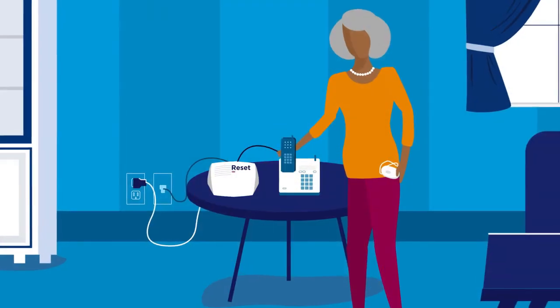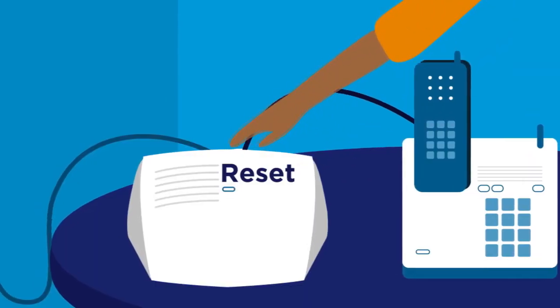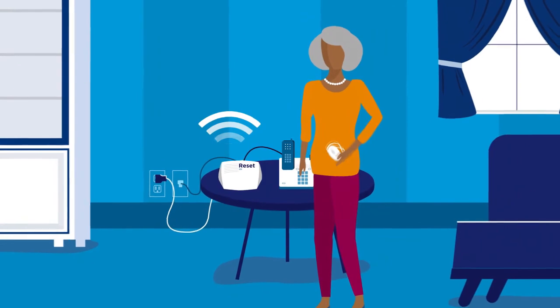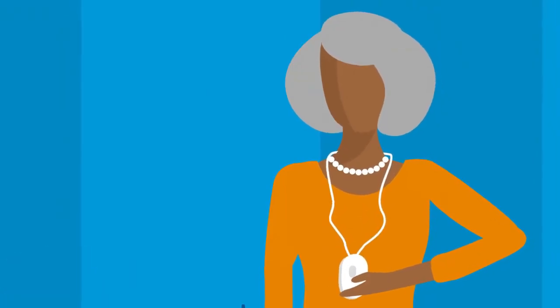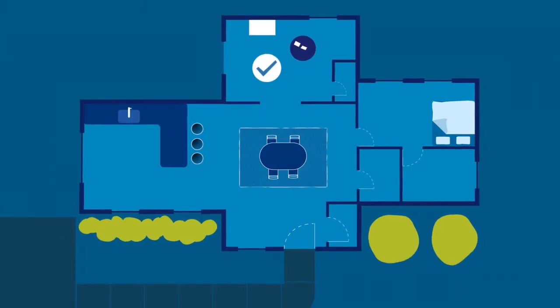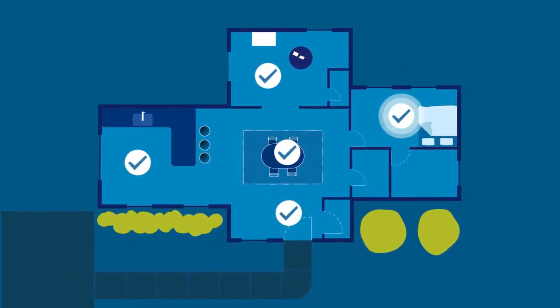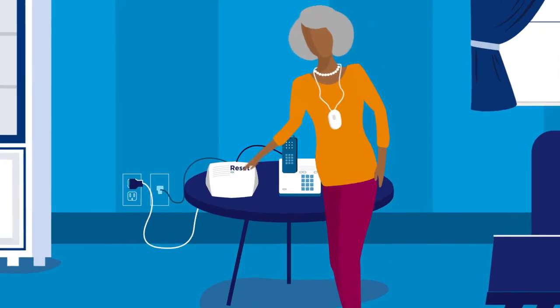Next, we'll test the range of your help button. Start by pressing and releasing the blinking reset bar on the home communicator. The home communicator will say, begin the range test. Put on your help button and press it in each room of your house. If the home communicator responds with a beep, it indicates that the help button is within range and will be able to send a help call if necessary. When you've tested your help button in each room, press the reset bar on the home communicator again.